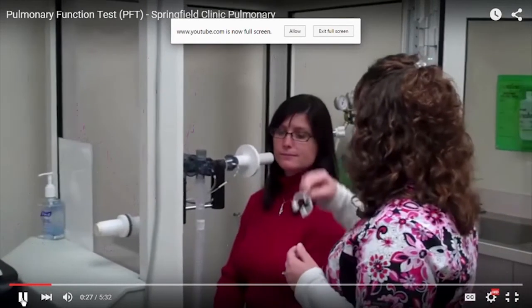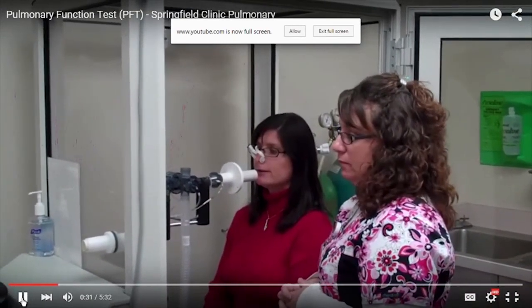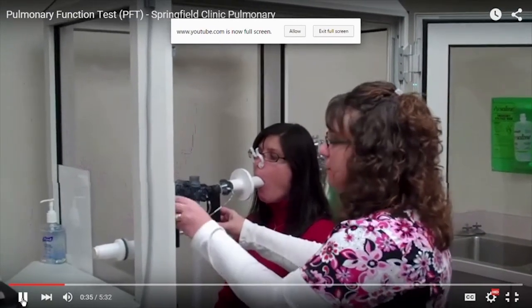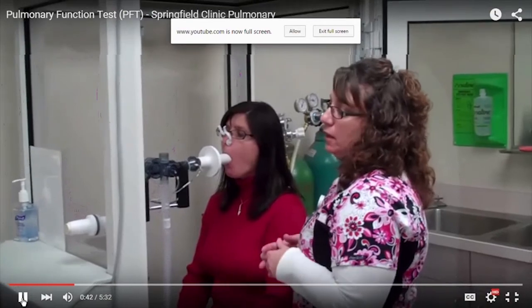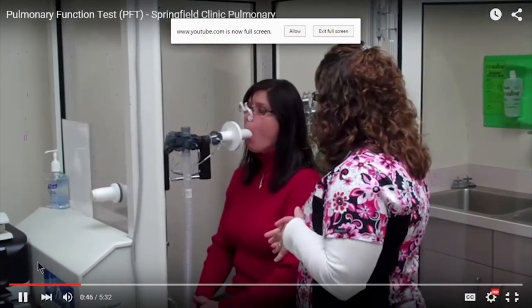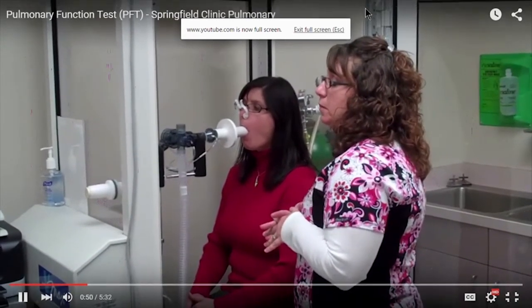First test we're going to perform is spirometry, and this is particularly good at assessing patients with COPD. Okay, go ahead and put your mouth on. Nice tight seal. You're going to start out breathing normal for me until I tell you. When I tell you, you'll take a big deep breath in, blow it out hard and fast. And you're going to continue blowing that one breath out until we empty all the air out of your lungs. Once your lungs are empty, then I'm going to tell you to take another big breath in.